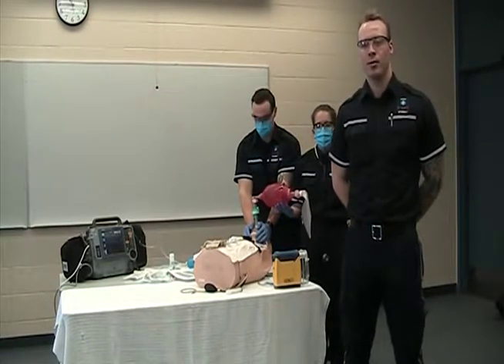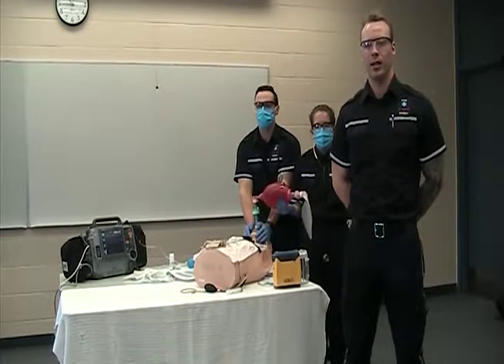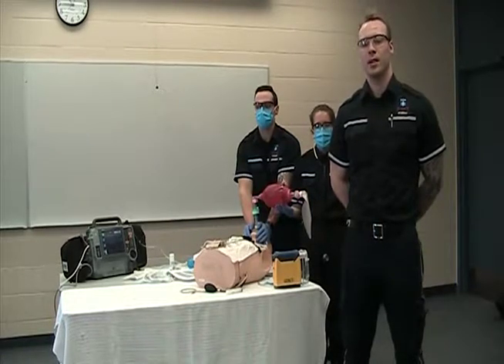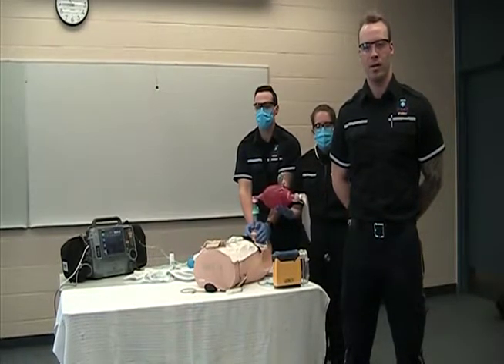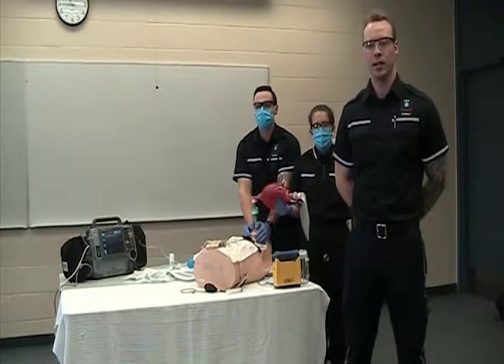Next thing we need to do is provide a LEMON score, and this will predict a difficult airway in an awake, conscious patient, ideally sitting up. So first thing is L. We want to evaluate, we want to look externally. We want to see if the patient has a short, thick neck, if they have any obesity, any external anatomical conditions that'll predict a difficult airway.